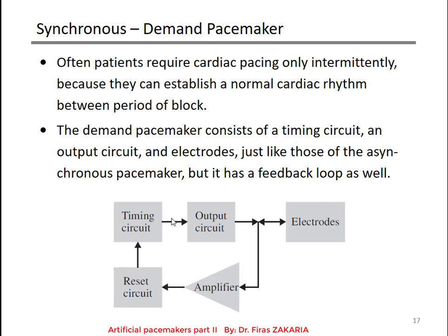So let me repeat. After each stimulus, the timing circuit and the output circuit deliver the stimulus to the heart. After each stimulus, this timing circuit resets itself, and it waits the appropriate interval to provide the next stimulus and to generate the next pulse to the heart.